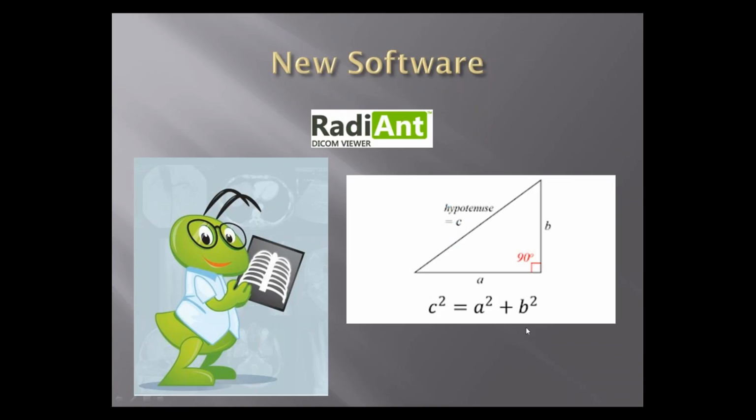Anybody know the name of this formula down here? Anyone raise their hand? Anybody remember geometry? See, I knew Greg would answer all the questions. Greg. Pythagorean theorem? That is exactly right, Greg. You win the golden prize.